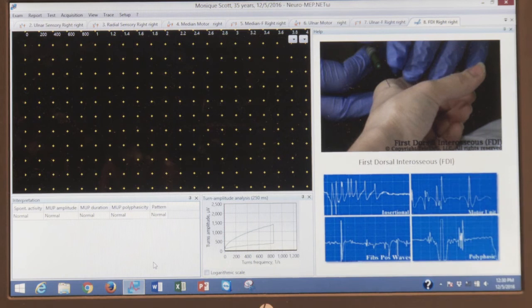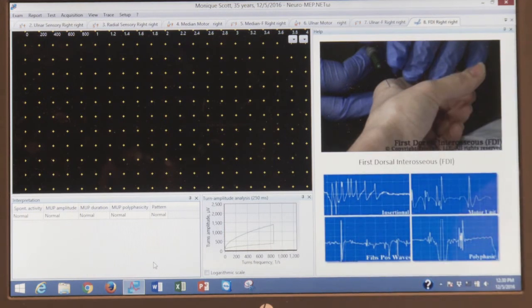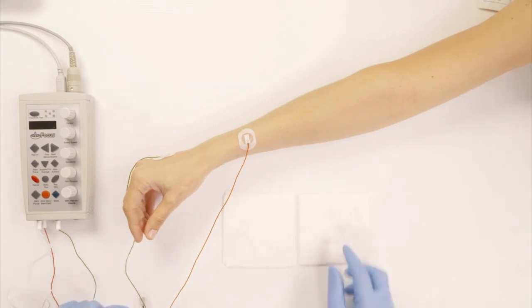The cloud actually is going to show you where the muscle activity is going to be stored in the computer for later analysis. So here we go. We're going to start with the first dorsal interosseous muscle.